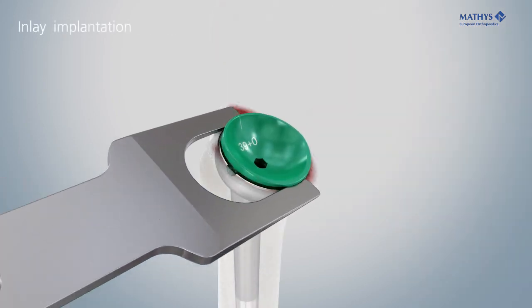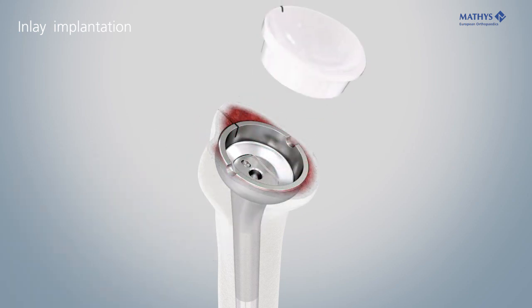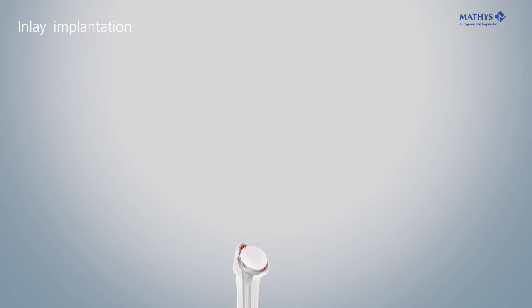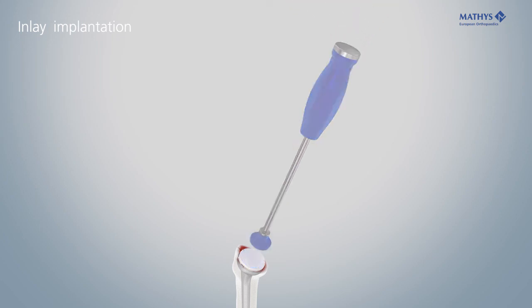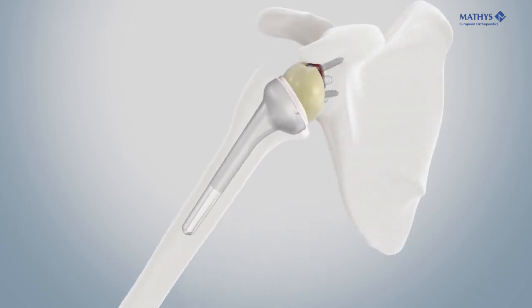Remove the trial inlay with the inlay extractor. Insert the inlay, ensuring that the lateral laser marking of the inlay is precisely aligned with the stem marking. Definitive fixation of the inlay is achieved by applying a distinctive hammer stroke onto the impactor in axial direction. Perform the reduction and verify the function.